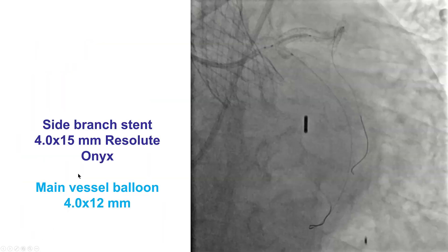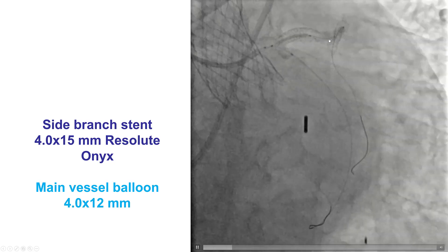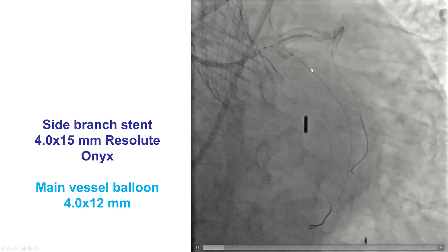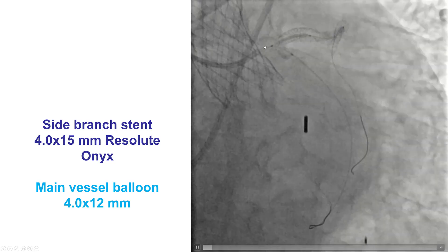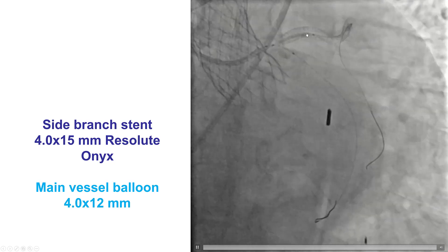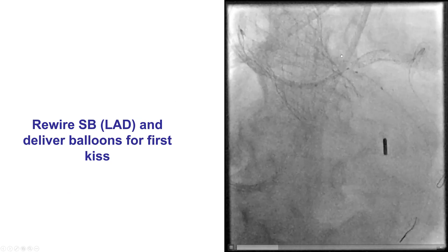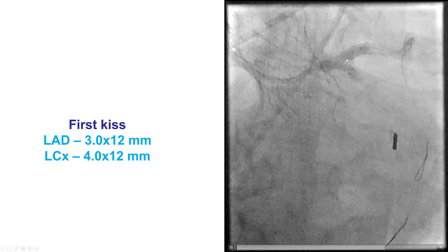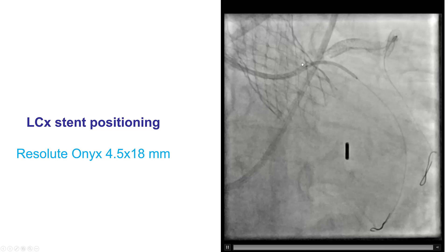These are the 17 steps of DK CRUSH. We decided to use the circumflex as the main vessel and the LAD as the side branch, based on the ease of rewiring — it was easier to get into the LAD than to take the bend that led into the circumflex. The vessel that is easier to rewire is always selected as the side branch. We deployed the stent, crushed it, then rewired and performed the first kissing balloon inflation, which showed good expansion of both balloons. We then placed a 4.5 by 18 mm Resolute Onyx drug-eluting stent from the left main into the circumflex, jailing the LAD.